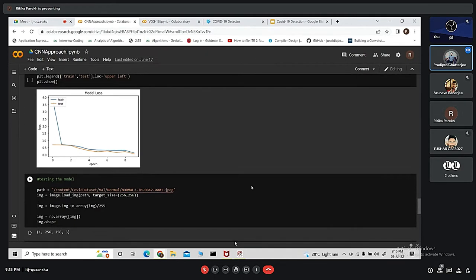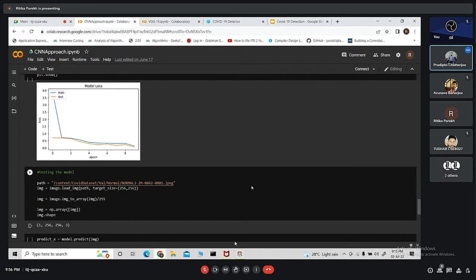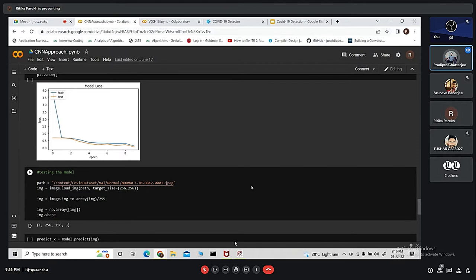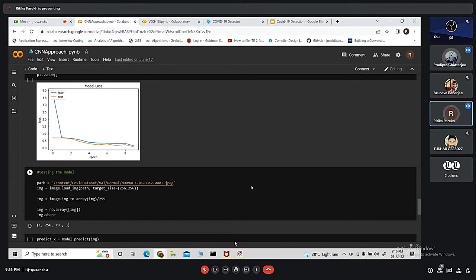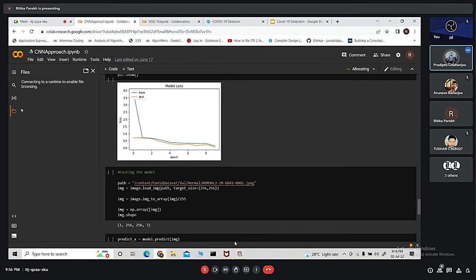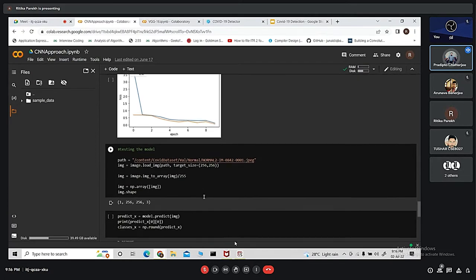For testing the model, we have all the dataset in Google Colab itself. Initially the data was in Dropbox and we have imported the data from Dropbox in Google Colab using a wget command. Then we have unzipped the entire thing and the data is managed in such a way that it has training folder and validation folder. Inside the validation folder, we have COVID positive and COVID negative folders.